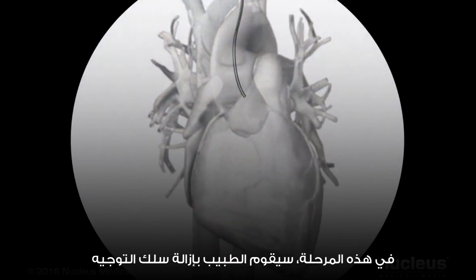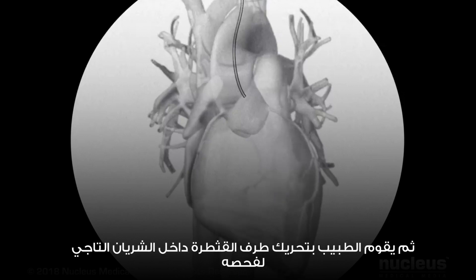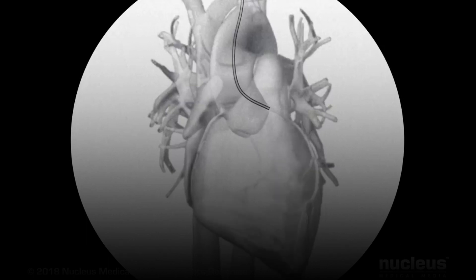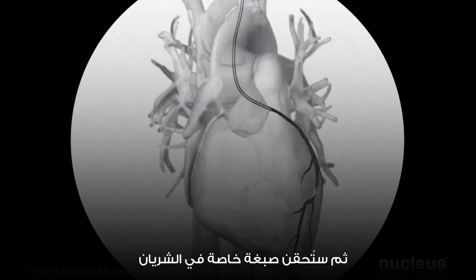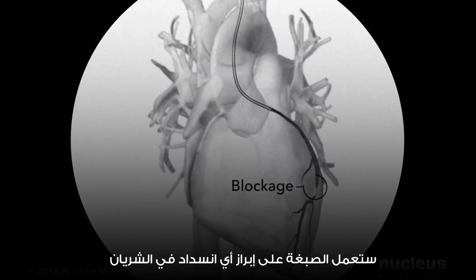At this point, your doctor will remove the guide wire. Then the doctor will move the tip of the catheter just inside the coronary artery to be examined. A special dye will be injected into the artery, allowing your doctor to view it better with the fluoroscope. The dye will make any blockages in the artery stand out.